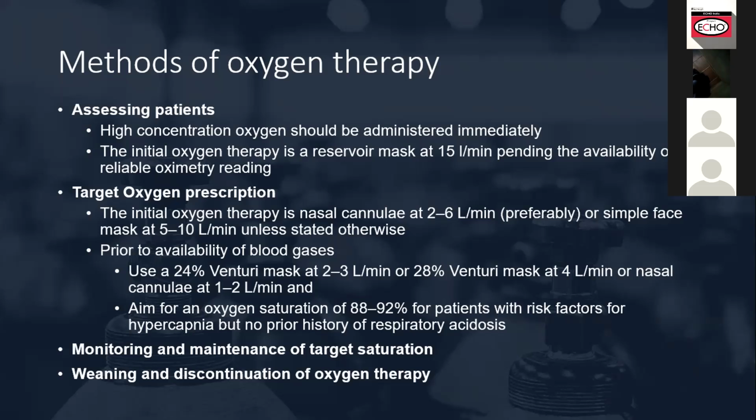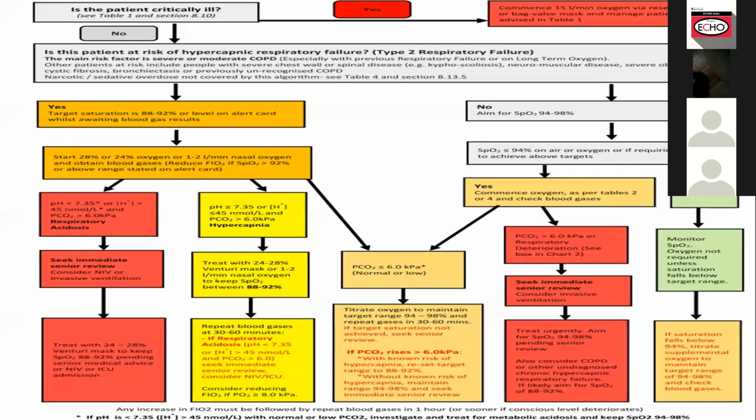Next slide. Really this is to show us how we can choose our best method, and how we can closely monitor and follow our patient if a patient is on oxygen. So remember, if you put a patient on oxygen, you will need really close monitoring to see if you are helping your patient.